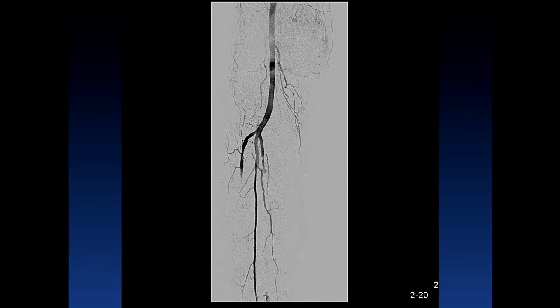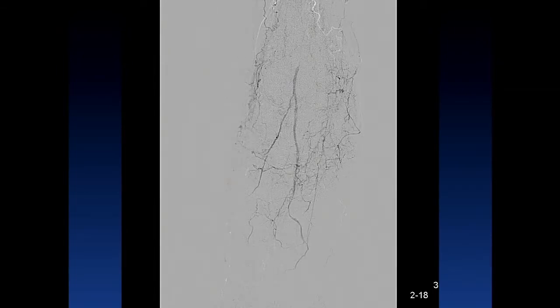You can see that the patient did not have any significant femoral popliteal disease. He did have some single vessel peroneal runoff, an occluded posterior tibial, and an anterior tibial that was occluded in its proximal course. Distally, the majority of the reconstitution of the foot was through the distal anterior tibial and proximal dorsalis pedis. There was some collateralization into the plantar branches, but very little flow, and certainly none in direct line flow to the area of the right great toe.